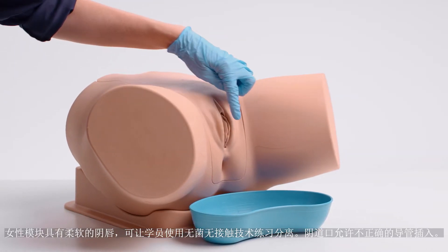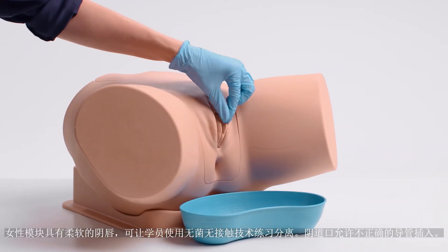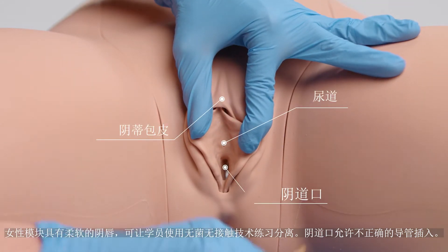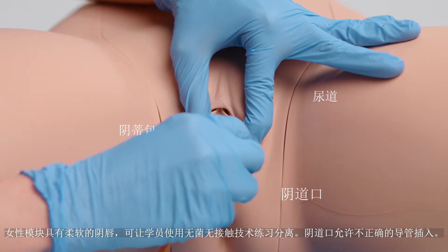The female module has a soft labia, allowing trainees to practice parting using the aseptic no-touch technique. The vaginal opening allows for incorrect insertion of the catheter.